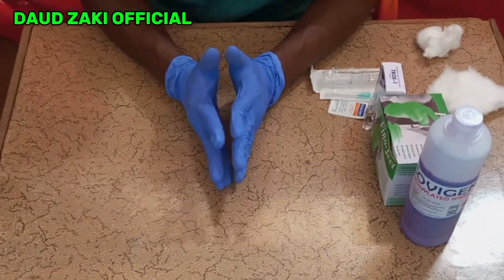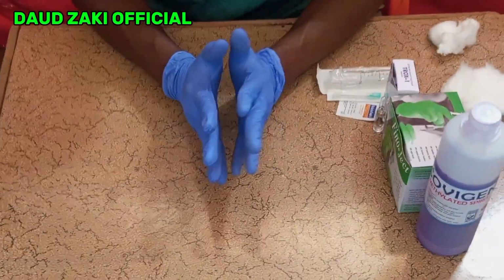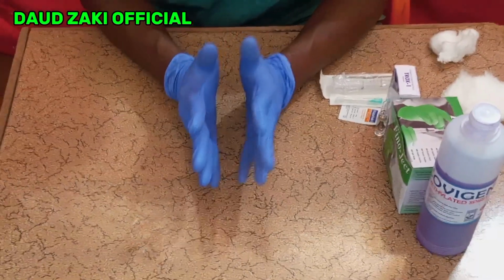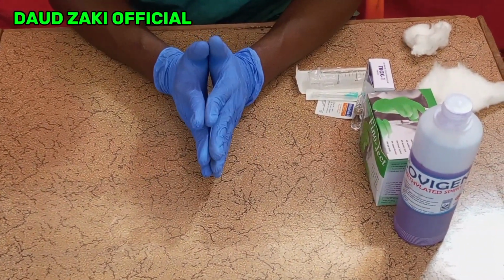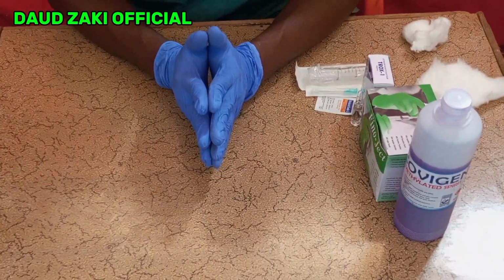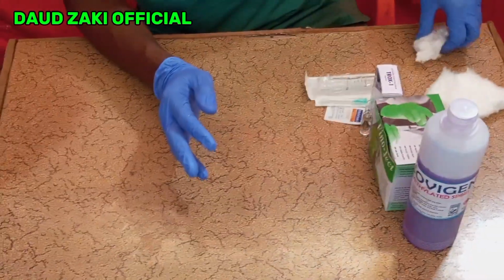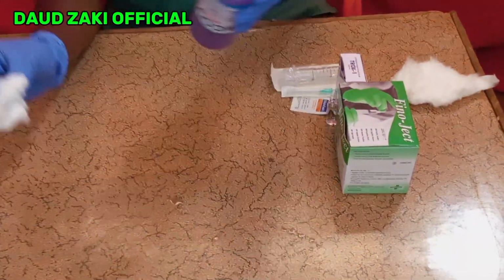In this tutorial, I'm going to show you how to dilute, how to reconstitute IV drug medication correctly for you to administer to the patient safely. So in today's video, I'm going to show you how to dilute IV medication correctly for you to administer to the patient effectively. So before you start the procedure, make sure first you clean your working bench.